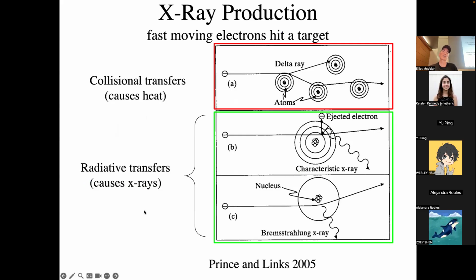So here's what happens when the electrons go into the target. Here's the electron flying into the target. It hits an electron in some atom and knocks it out as a very speedy electron. The original electron gets deflected in this direction, and the new electron gets deflected in that direction. So now I have two electrons flying through this stuff. Then that one hits again, and one comes out, and you get a shower of electrons, and all of that gets absorbed as heat energy, just kinetic energy put into the system. So this is what mostly happens. This doesn't help us at all other than heating up the target.